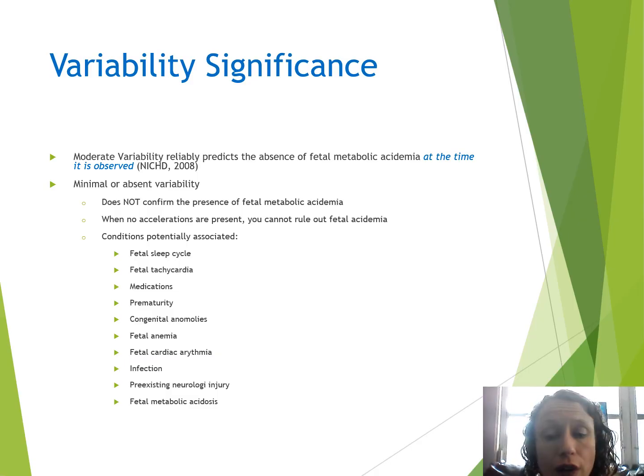Okay. Fetal tachycardia. If their heart rate is really high, greater than 160, that's fetal tachycardia, and you'll have less variation. Medications: if something's chilling mom out, it's going to chill out baby too. So if we're giving her something like diphenhydramine, morphine, fentanyl, Phenergan, promethazine, something along those lines, it is going to chill out baby just like it does mom.